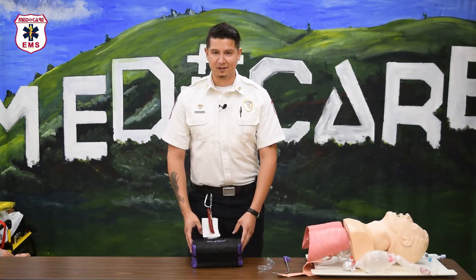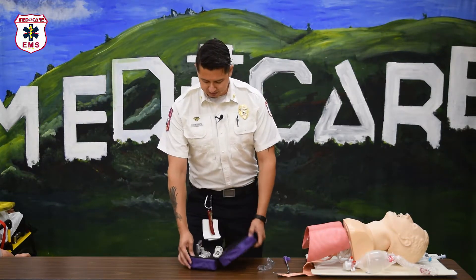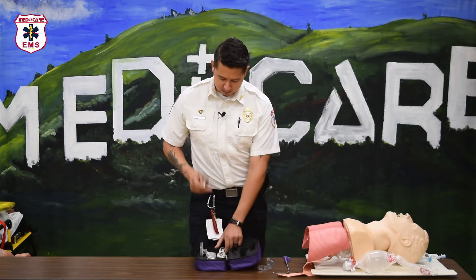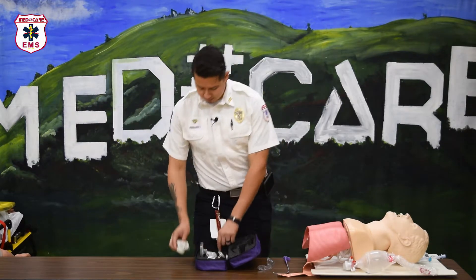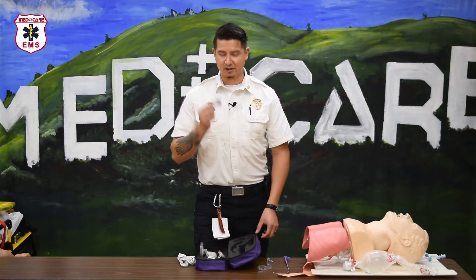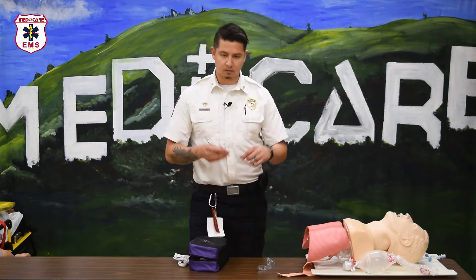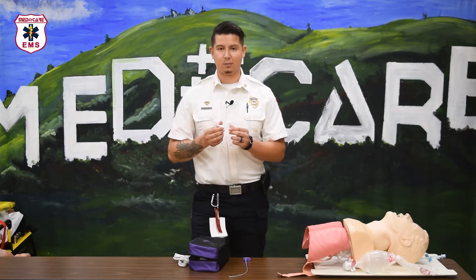All the components of the video laryngoscope come together in a soft shell case. Inside the case you'll find the monitor and handle along with the wand, data transfer cable, charging cable, additional battery, and SD card reader. Additional equipment includes rigid stylets and disposable MAC blades that go over the wand.